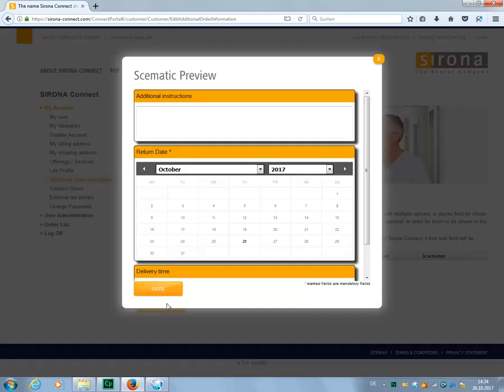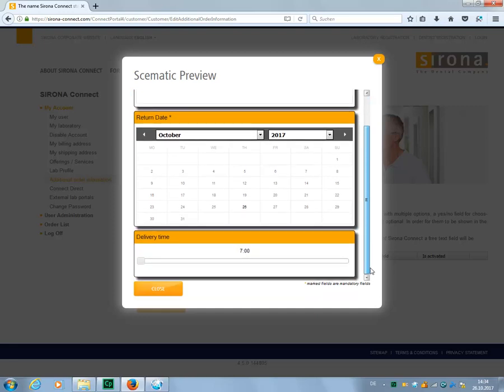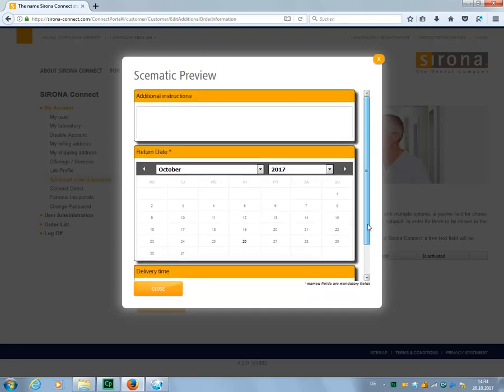In the schematic preview, there is a text box for entering instructions from the dentist, a calendar view to specify the return date, and the option to select a specific time for the delivery. Let's close the preview so that we can start designing the order form.